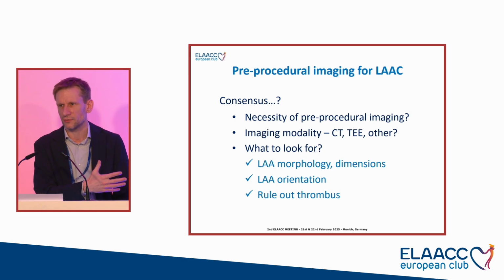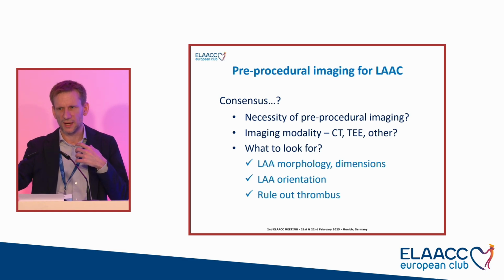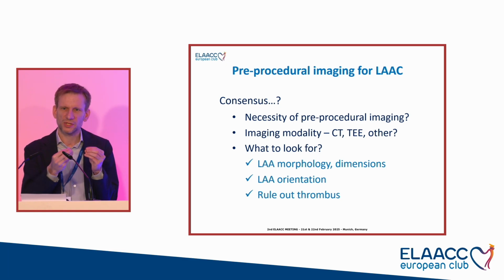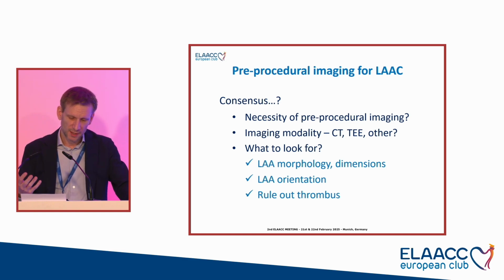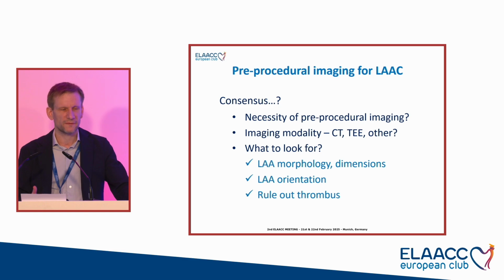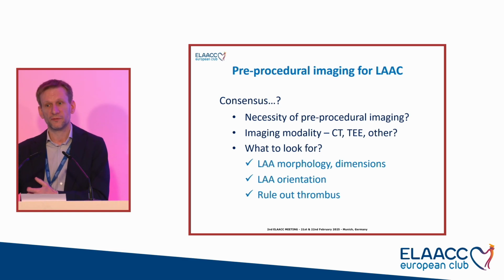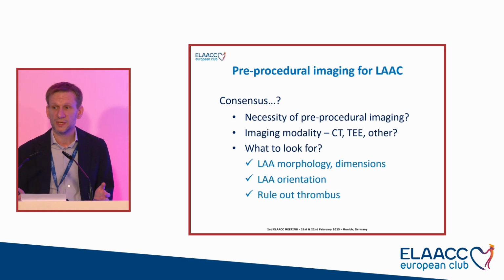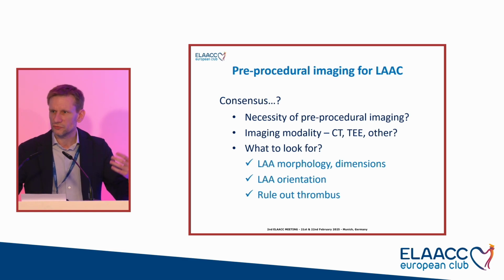Of course, I get what you get out of doing the TE pre-procedurally. As Adele says, you understand the anatomy, you go prepared into the lab, you rule out the thrombus if you do it the day before. But still, the additional information you get is limited because you repeat it intra-procedurally. What I think, from a pure practical point of view, is that if I have a CT beforehand, I get information which I never have from TE or from my intra-procedural imaging, like, for example, the most optimal implantation view, which is really key for me to do this case, to make it faster, and not to make a lot of contrast injections, etc.